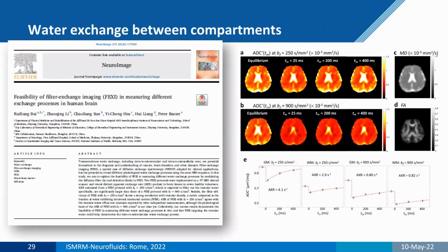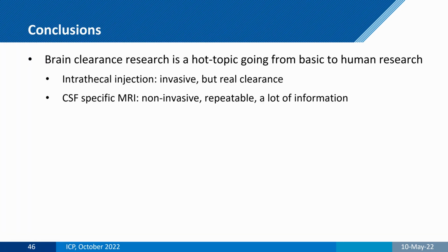A very similar technique, and I won't go into detail, is the FEXI technique, which is more a diffusion-based technique. The main conclusions: brain clearance is a hot topic, and I really think we see a tendency to go from basic research to human research. The intrathecal injection I would still consider the gold standard, but it's very invasive.